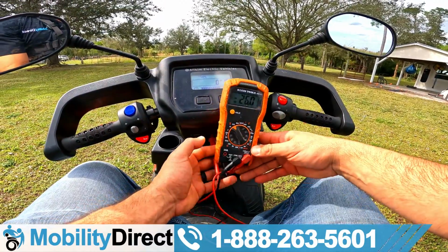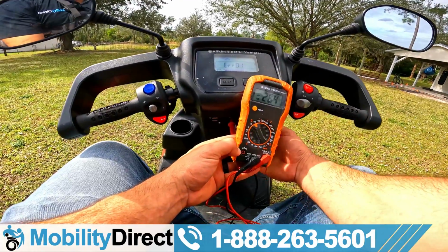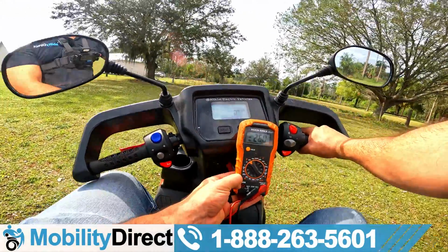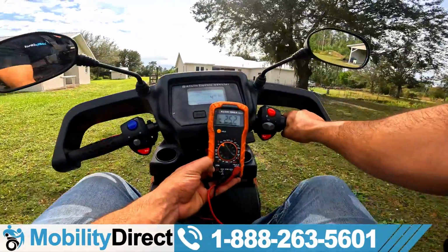And okay, so now I'm getting the error 1 code again. So I'm gonna reset power, and I think personally, because dropping down low on an incline is pretty normal, right? It's really working a lot to try and get up that incline. I'm gonna test out the connections next.